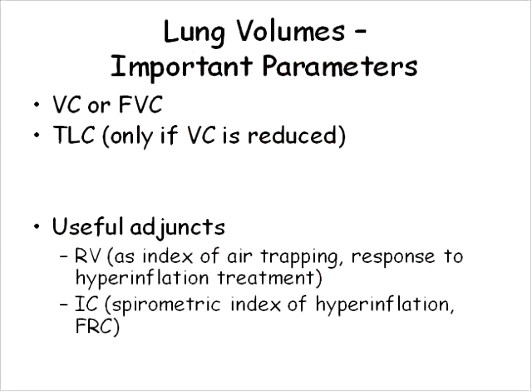In other words, if you know what the individual's total lung capacity is, is that going to help make a better diagnosis? Is that going to help in planning a therapy for a particular patient? And that's assuming that those things can be measured accurately. So again, that's kind of the key issue in terms of lung volumes.